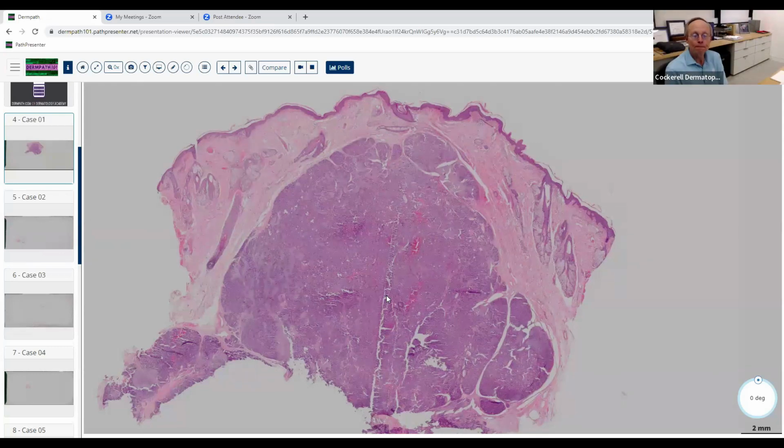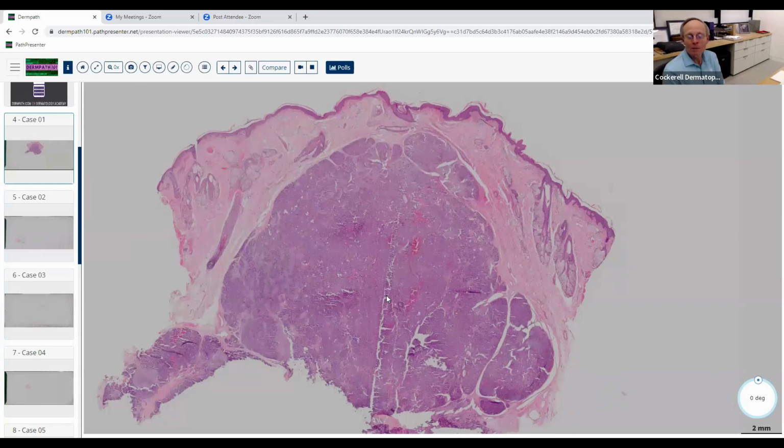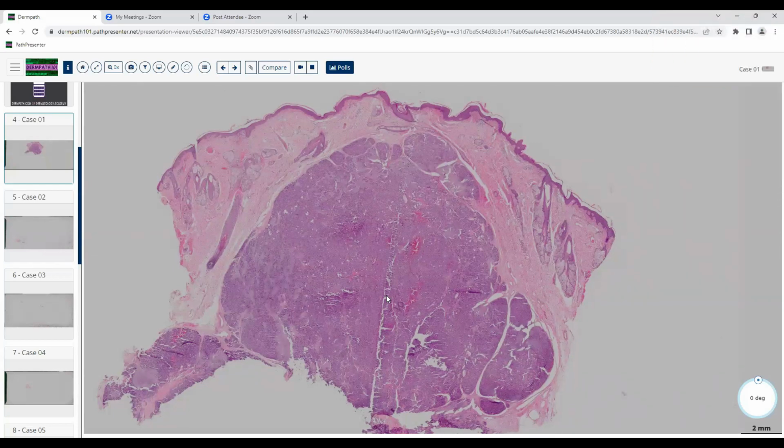Good, excellent. Is there any exception to that rule, by the way? Now that we're in the end of the year, we should know all the little minutiae at this point, right? Yes, I'm sure there's an exception. Well, if something looks benign at low magnification, like a round nodule that looks symmetrical, always think of a metastasis, because sometimes those can look benign at low power.